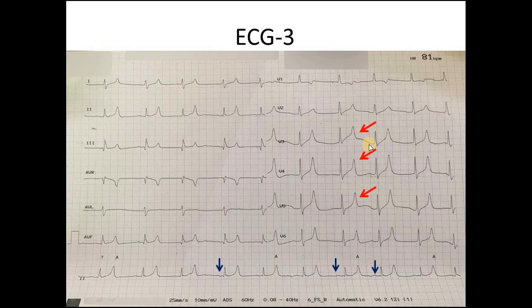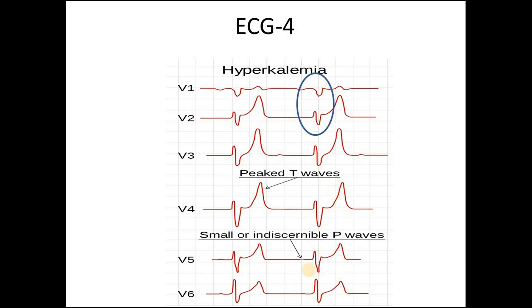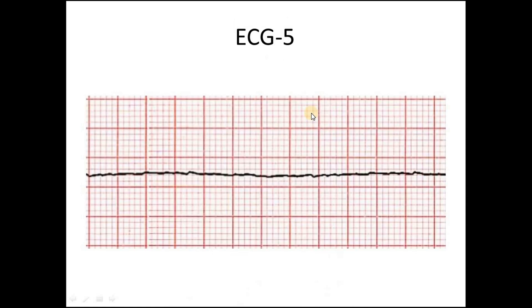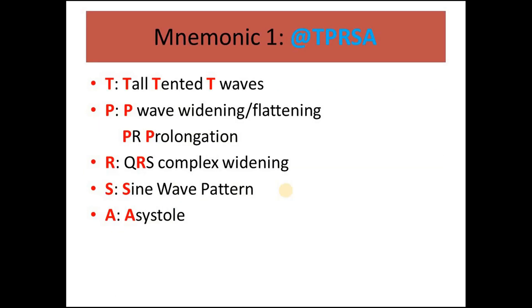In the third ECG, red arrows show the tall and tented T waves, and dark blue arrows show the flattening or absence of the P wave — a typical feature of hyperkalemia. The fourth ECG again shows tall tented T waves, small or flat P waves, and a wide QRS complex. The fifth ECG shows asystole, which is the end result of severe hyperkalemia if not treated in time.